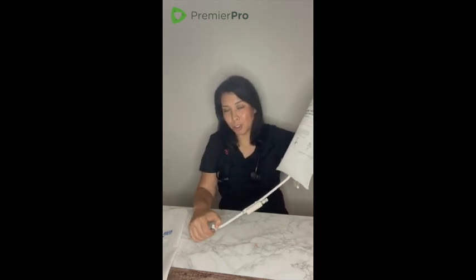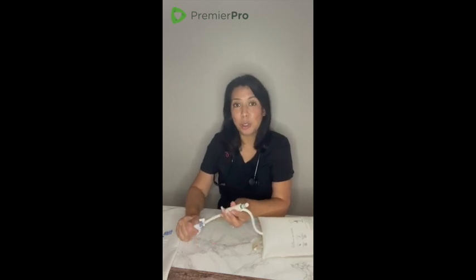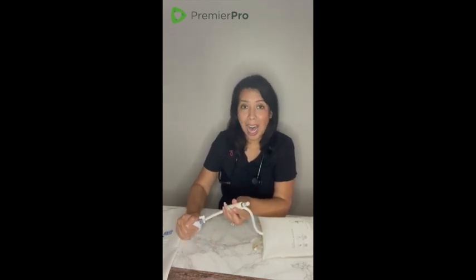Now, there's one last feature I want to talk about on the bag. I'm going to turn this back to the inflate position. The pressure gauge itself is equipped with an anti-overinflation valve. So if you go too high and you start to get into that red zone, and I'm gonna talk a little quietly here so you can hear it, you should start to hear a hiss.